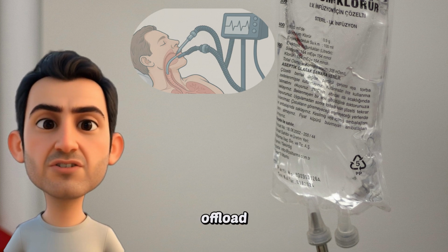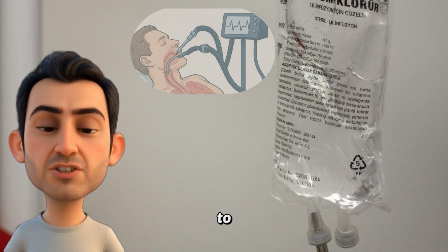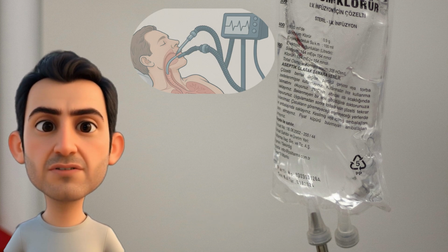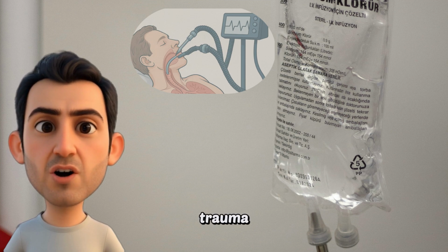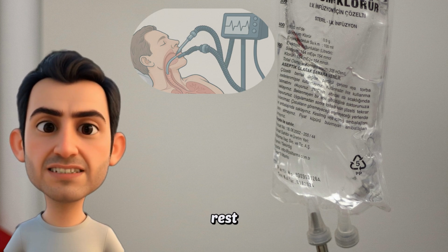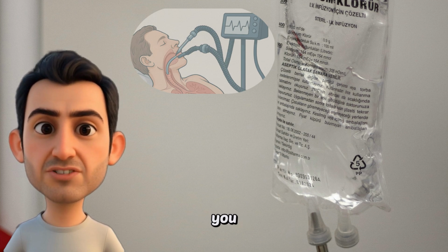2. To offload carbon dioxide, especially in hypercapnic states. 3. To reduce the work of breathing when the patient is just too exhausted. 4. To protect the airway. Think trauma, overdose, or seizures. And 5. To give the lungs time to rest and recover. You need to know which reason applies, because that shapes how you set the vent.